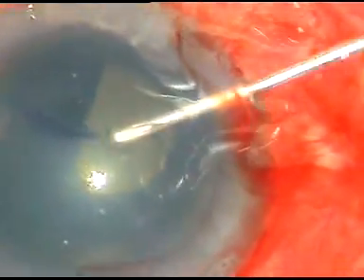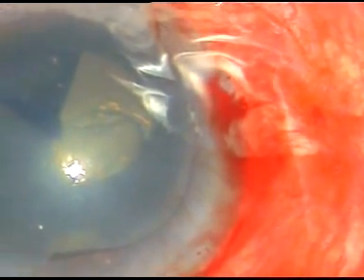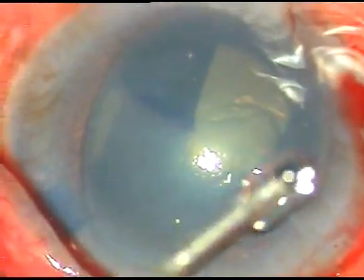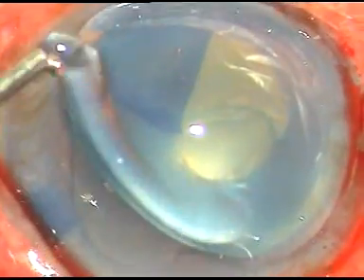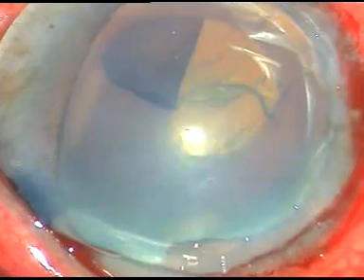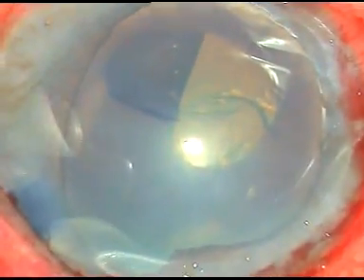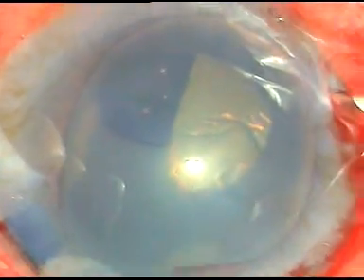Now I'm going to apply viscoelastic substance over the epithelial surface of the cornea so that visibility becomes better, and it has become better.